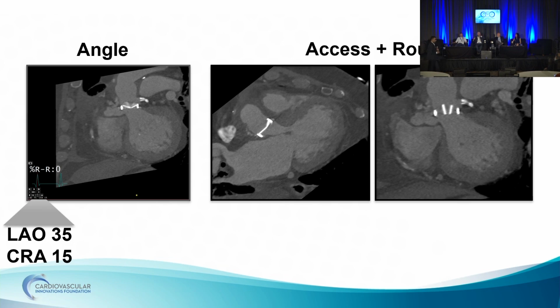If you ever have a caseous MAC that erodes and you get a pseudoaneurysm that way, or anything around the mitral annulus where you have to come down through the mitral and then hook back up, the AL platform works nicely. Whether it's a 1 or a 2 or a 3 just depends on where you're going and how much reach you need. But I've found that works reasonably well.